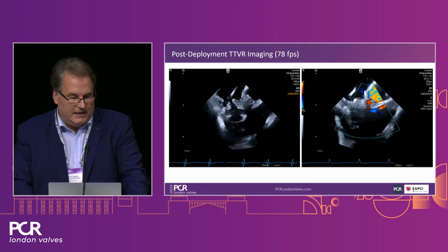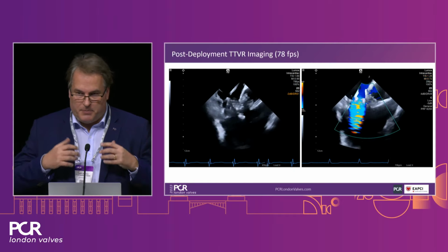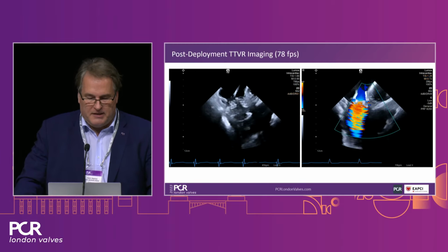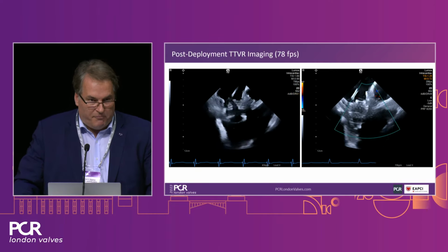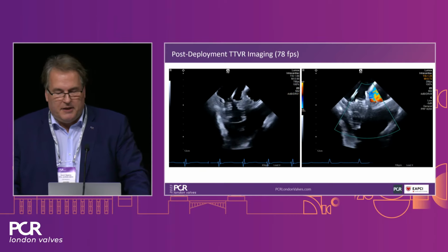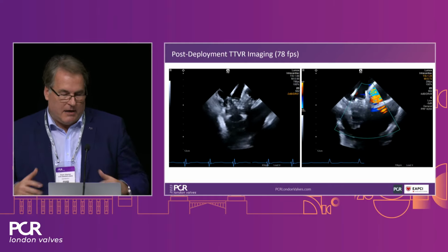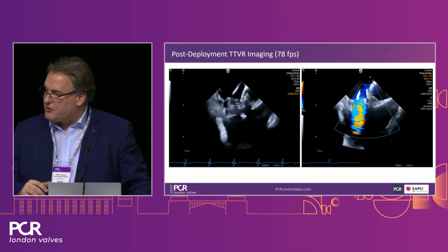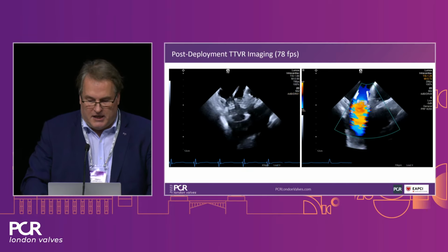And here we can see the implantation of the device, which is a Topaz valve. A Topaz valve doesn't need to be secured on the leaflets. It's a longer stent. It's a German-French development that engages a very soft single stent design together with porcine leaflets. There are only 19 patients treated so far worldwide. And this was the first case ever to do this with a pacemaker cable. Because the company in the beginning was afraid, of course, that the very soft stent design would have trouble in engaging the pacemaker cable and putting it to the annulus.